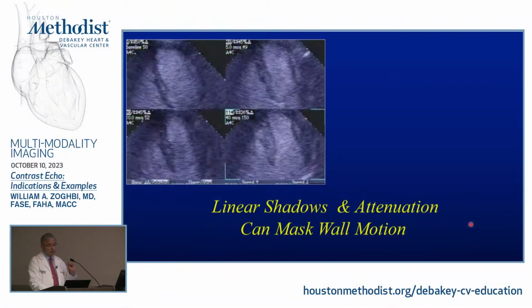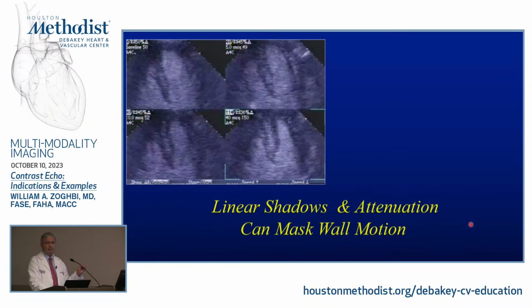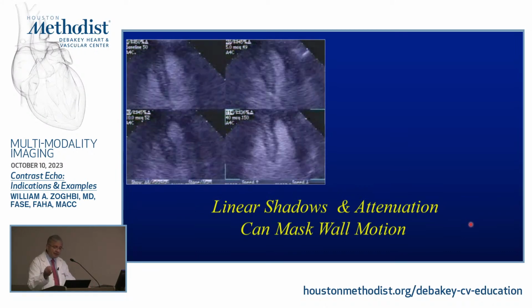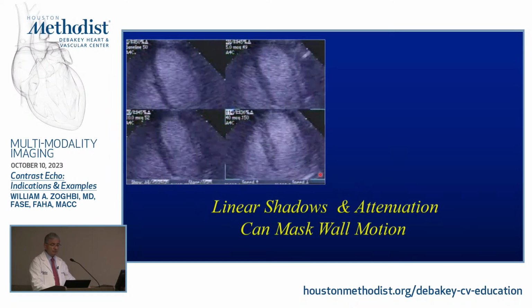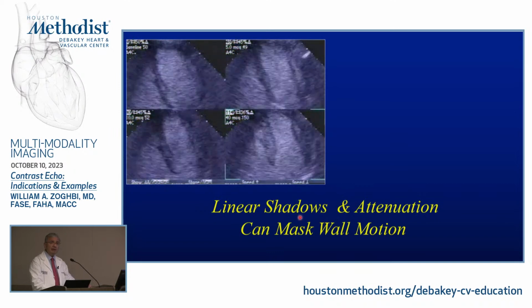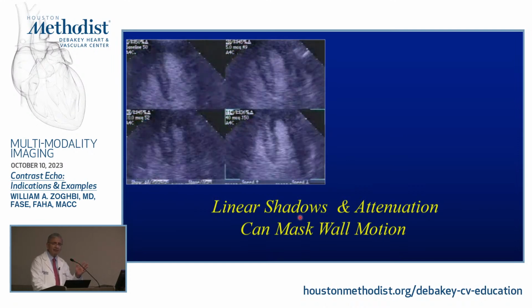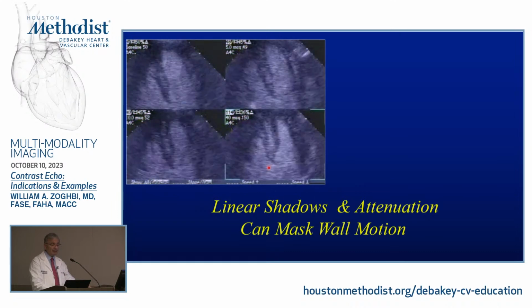And I cautioned you that these are the ones that are really pristine echocardiograms. Some of them are beautiful images, no matter where, how. You should not use contrast. And the reason for it is contrast has its issues. You have some linear shadowing. Whenever you see within the ventricle a straight linear endocardial border, be careful about shadowing.